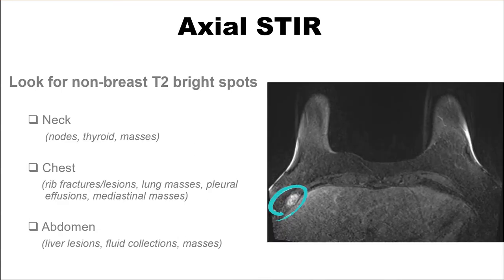Finally, on the STIR sequence, look for any bright spots that aren't in the breast. Occasionally, you'll find neck masses like large lymph nodes or thyroid masses. You may find an abnormality in the chest — rib fractures or rib metastases, lung masses, pleural effusions, mediastinal masses are all quite common. Or in the abdomen, you may find a liver lesion, a fluid collection, or any other mass.